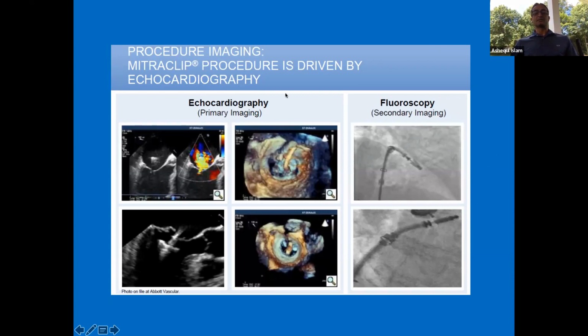No offense to the women who are here, but that's sort of a funny way of looking at the mitral valve. They're very complex. You have to understand the anatomy. You have to understand the pathology to be able to do a meaningful repair, whether you're doing it surgically or by transcatheter technique. Fluoroscopy definitely is part of the procedure, but of course we have to do it under TEE guidance. And 3D has really revolutionized the procedure, its safety and technical success.